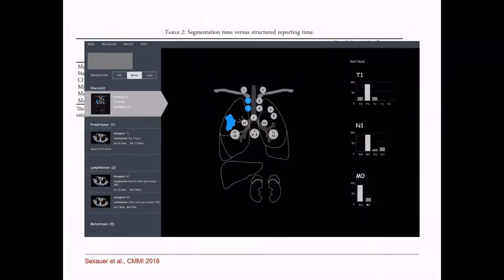That's just a mock-up of how that could look in the future, where we maybe have thousands and thousands of those structured cases with features extracted from these lesions. We could say, with a high probability, this lesion is a T1 lesion or a T2 lesion because it looks like this or that, because we have a structured library of lesions behind it. Instead of a doctor saying, well, I've trained in this for 5 years, and I think it's T1.